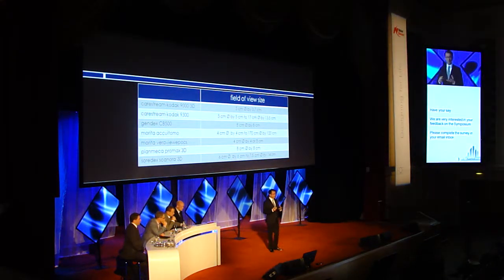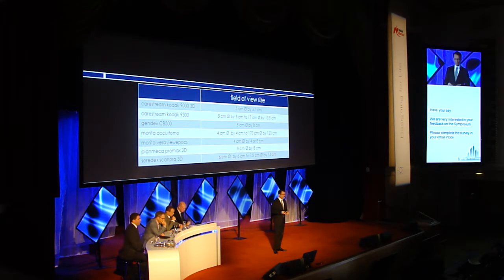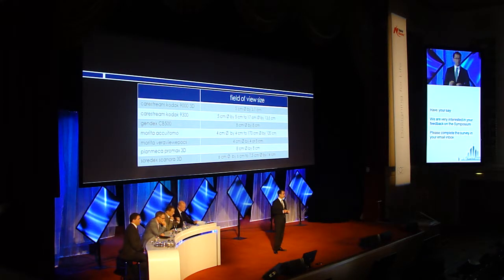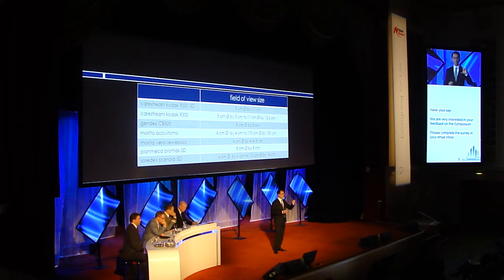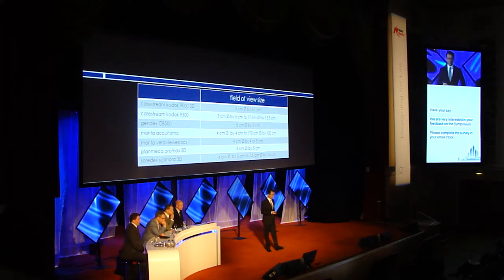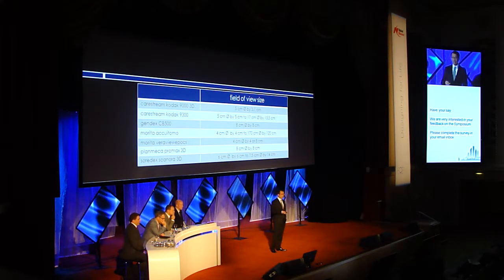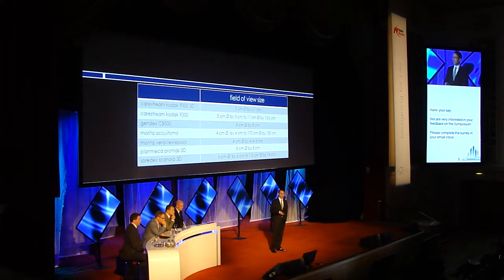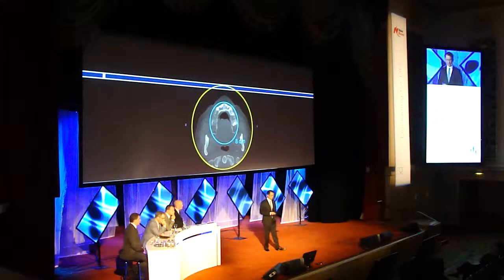Many of these systems do have small fields of view, and they range from as small as 4 centimeters in diameter to 4 centimeters tall, up to about an 8 centimeter diameter field. And as I said, many of these systems are quickly being introduced in the market, and many of you may actually already have such systems.